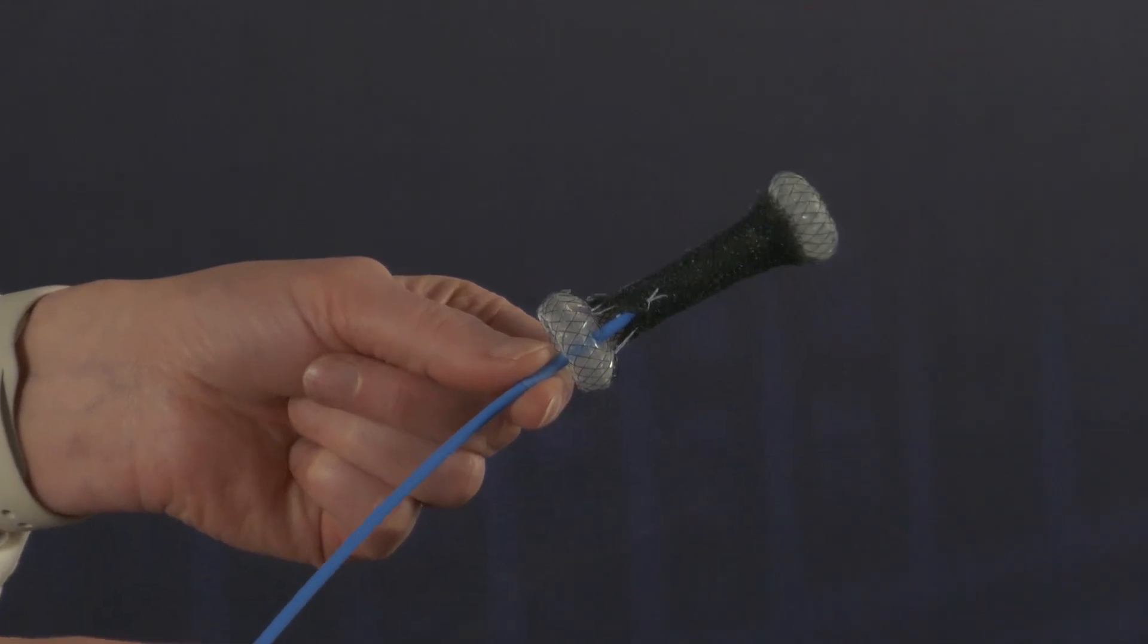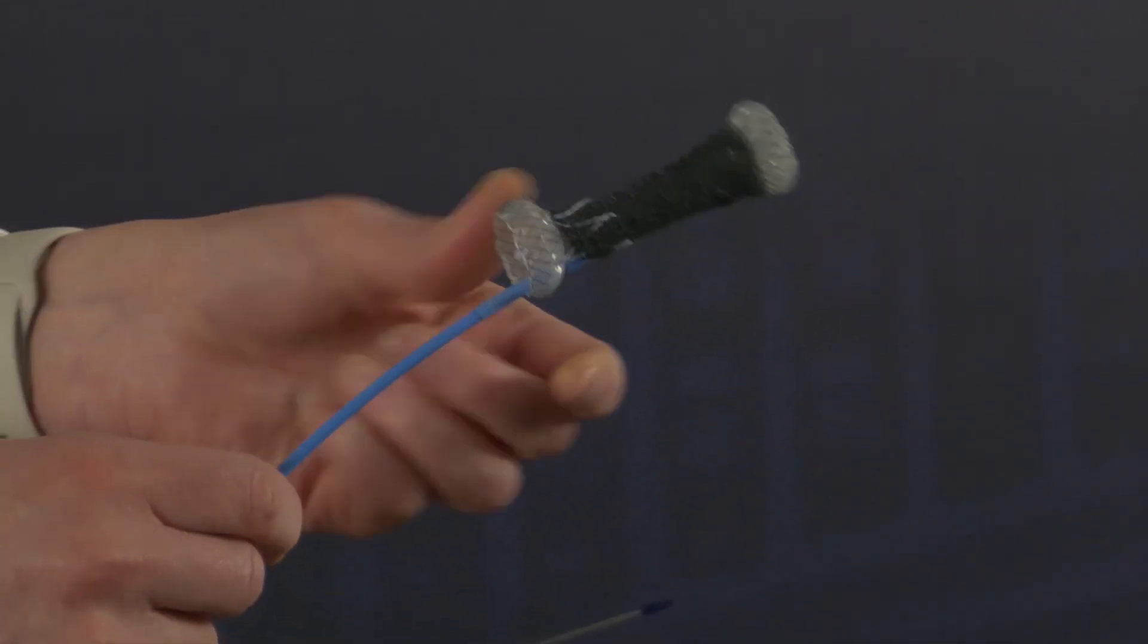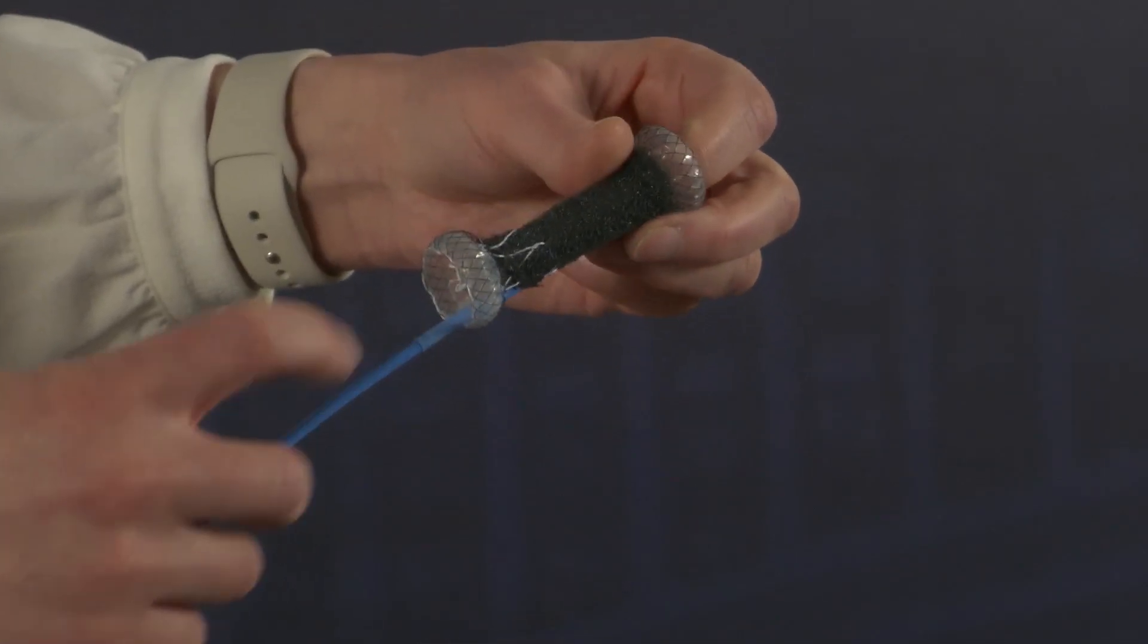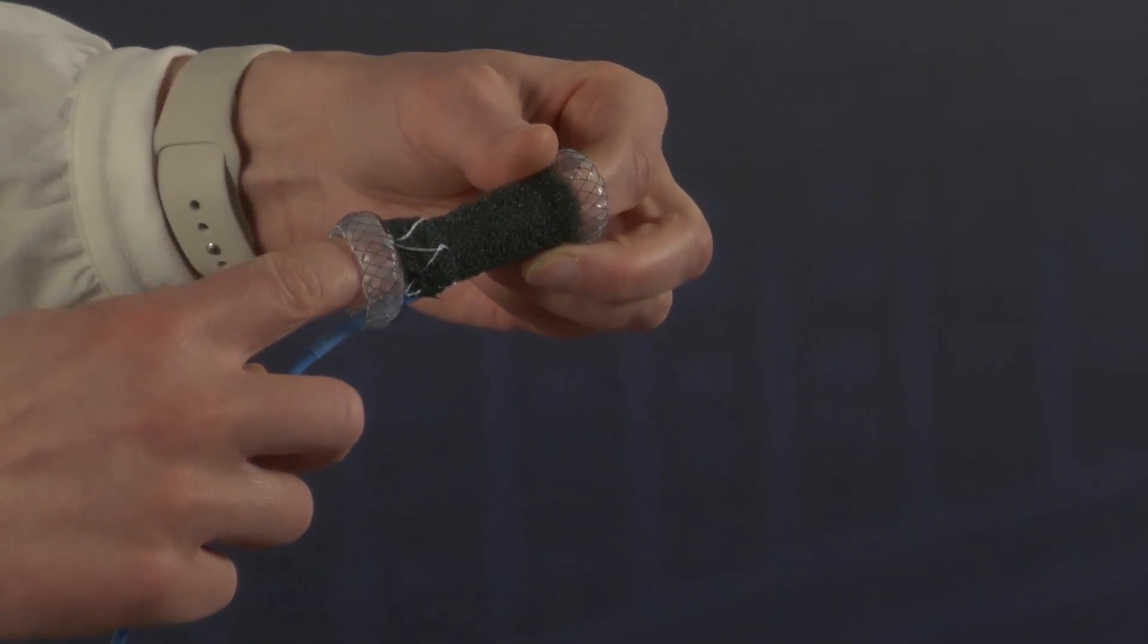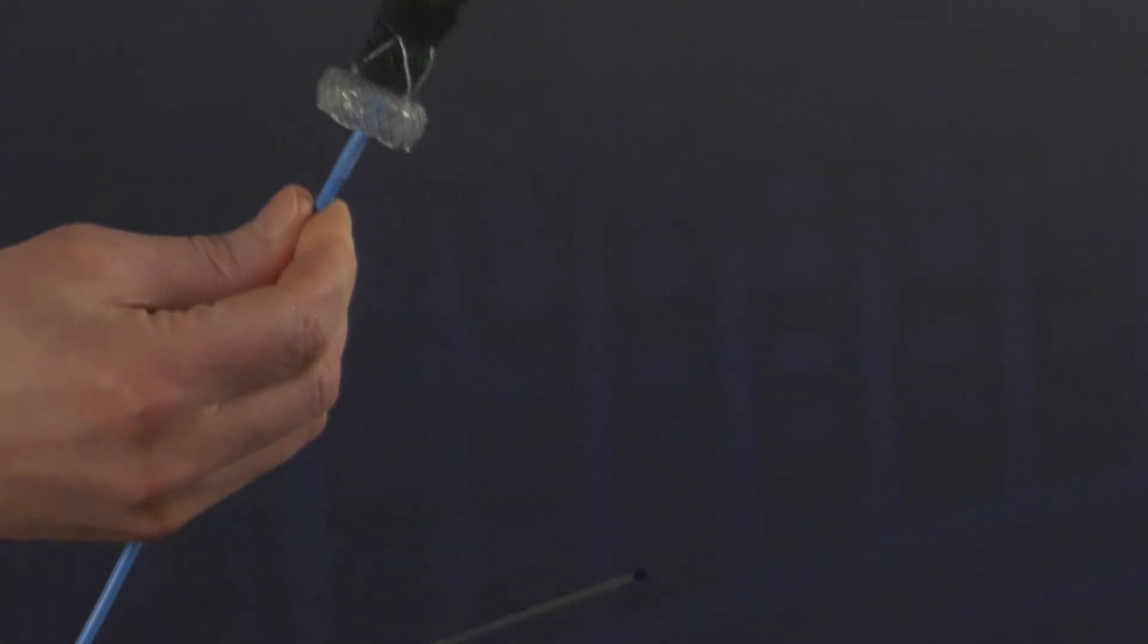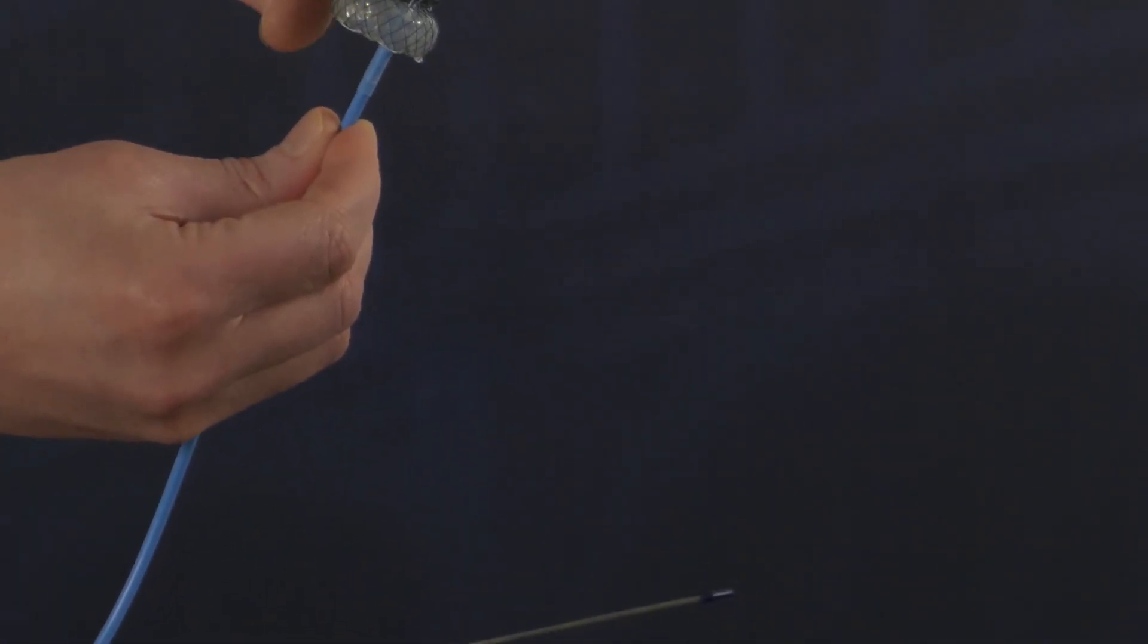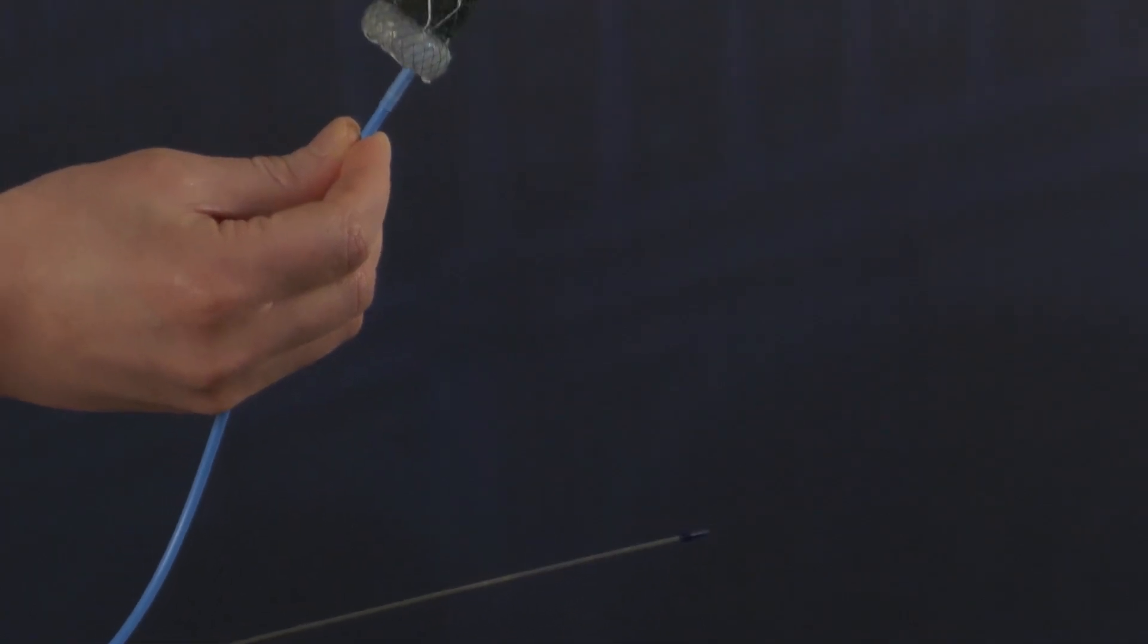Once you have placed it, you can immediately connect it to the vacuum and then the stent will even deploy further. I will just do it a little bit with my fingers and you can see how it looks.